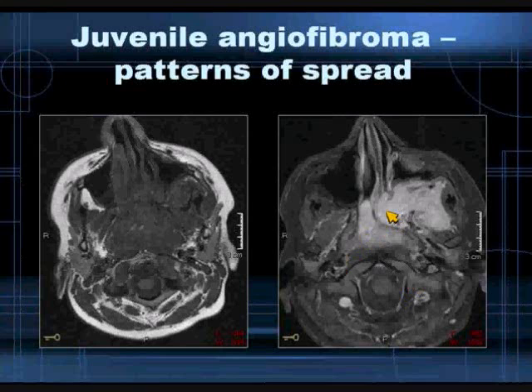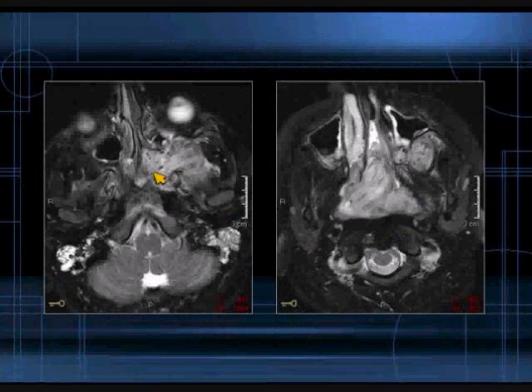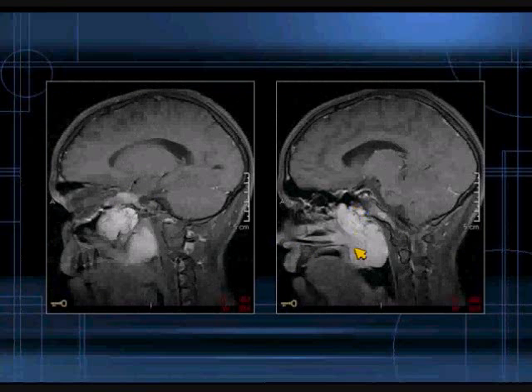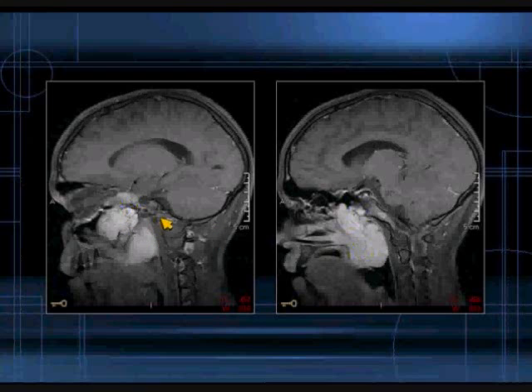How do these lesions spread? On MR examination, a fairly characteristic lesion blows out through the pterygopalatine fossa into the nasopharyngeal masticator space, extending posteriorly into the choana and sometimes into the nasopharynx. Here, this lesion actually fills the nasopharynx, resulting in bilateral mastoid effusions due to the bulk of disease. On the sagittal images, gross disease is visible in the choana extending toward the oropharynx, as well as disease invading the sphenoid bone into the inferior orbital fissure.